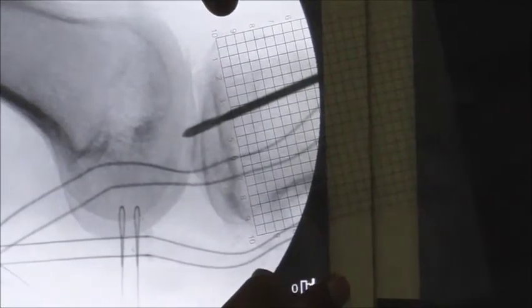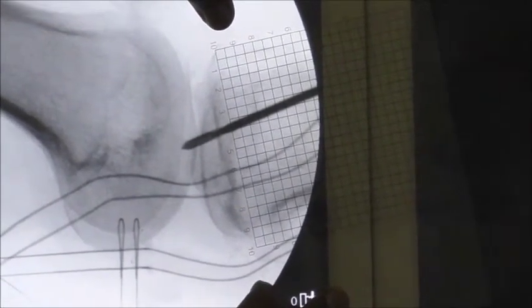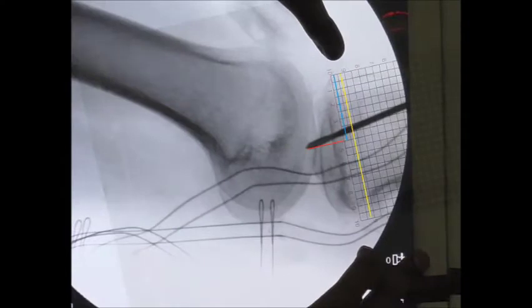And once the transparency grid is superimposed from front to back, the entire width is 20 boxes and the guide pin is exiting at 9 boxes. So 9 by 20 gives us 45%, which is where we want to be.